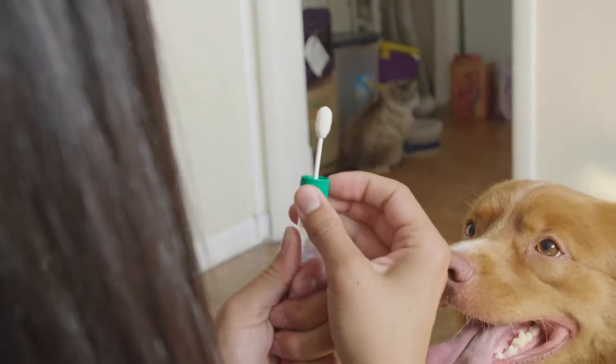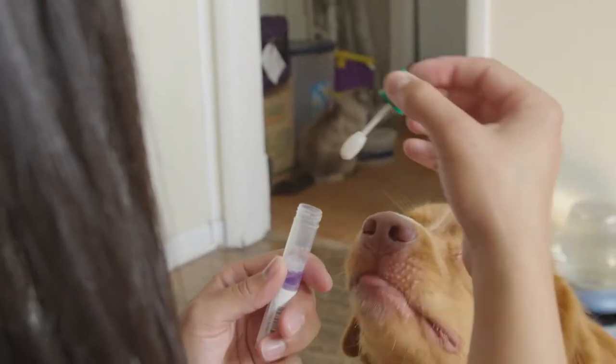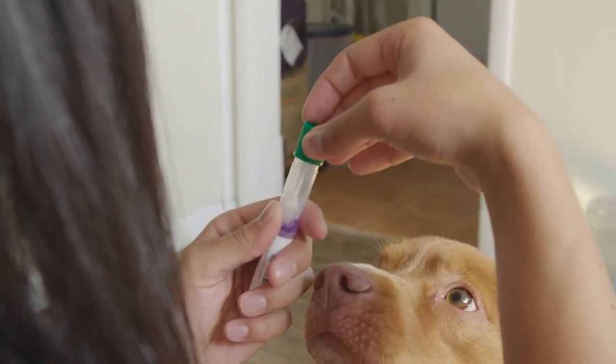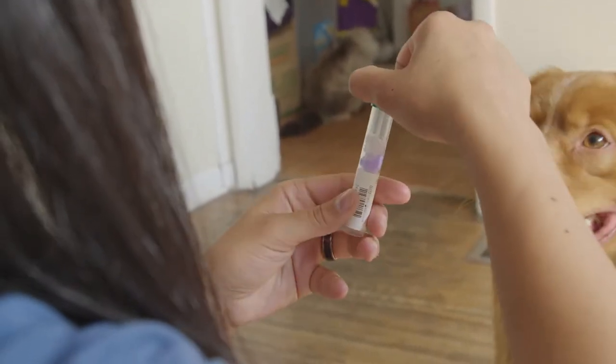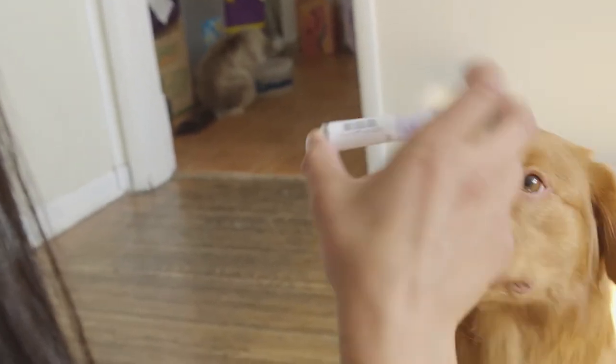Hold the tube upright and carefully unscrew the green cap. The tube contains stabilizing liquid — do not spill. Return the swab to its container so that the swab is in the liquid. Screw the lid on tight and then invert it 10 times up and down to mix well.